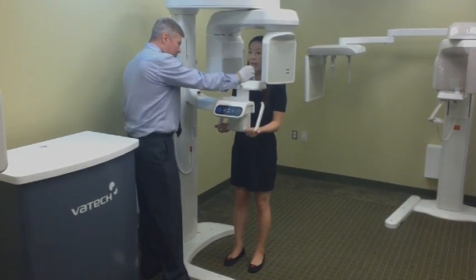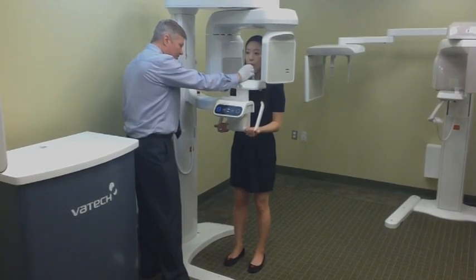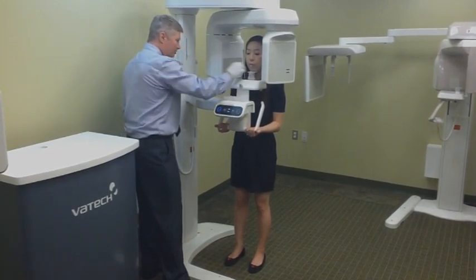Okay, open up your arch for me if you would. Come on a little bit forward. And then bring your teeth a little further forward again. And put your teeth in the groove there. Perfect. And pull it down just a little bit so it's firm here on the chin rest here.